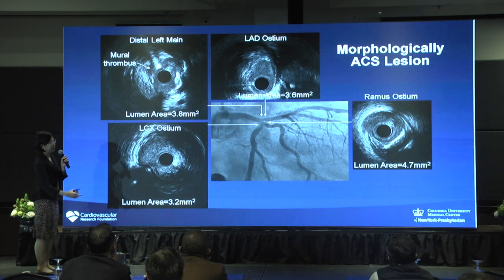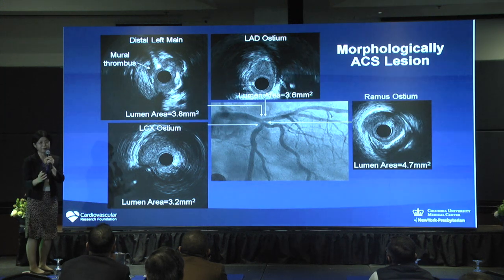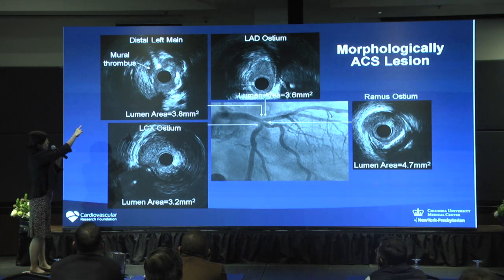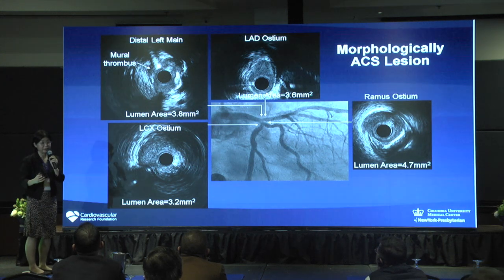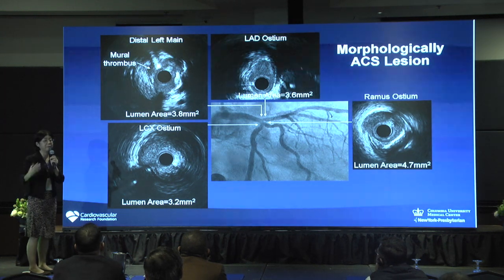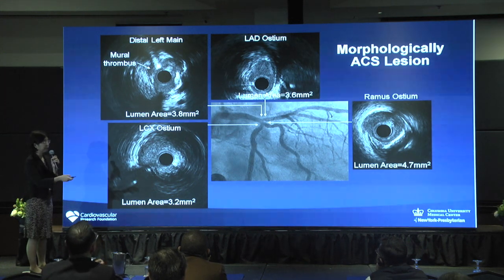So altogether, we confirm this is very significant, but not only the significance in terms of the lumen, but also the plaque morphology. I see the thrombus on the top, and deep side, I see the plaque cavity, so that's indicating probably recent plaque rupture, organized thrombus, that's causing this type of stenosis and the patient's recent symptom. So that's a very important left main.